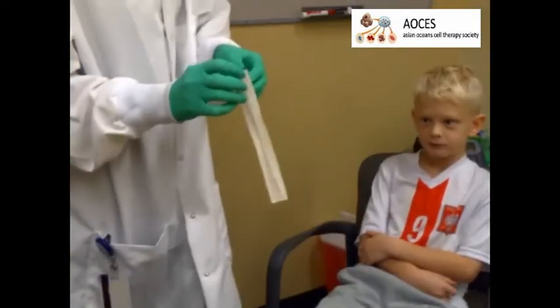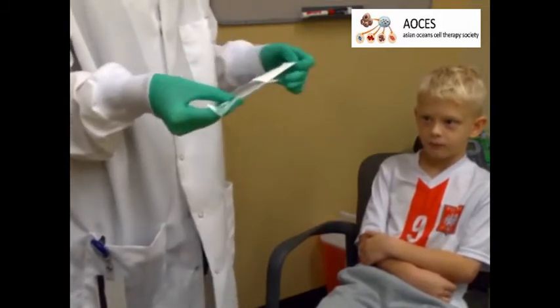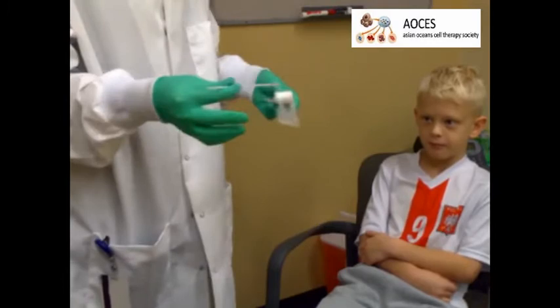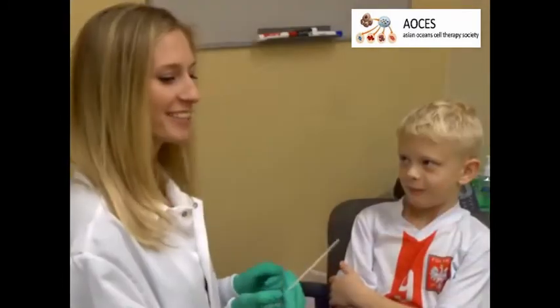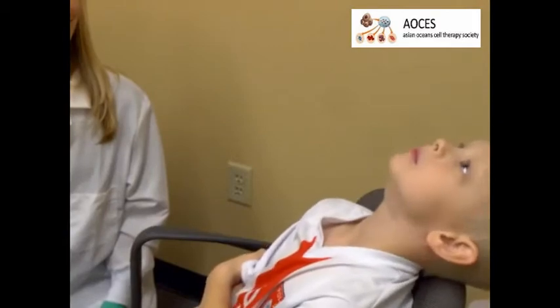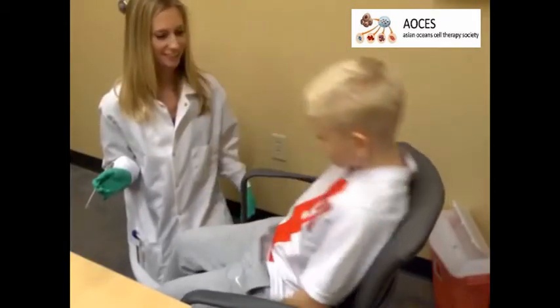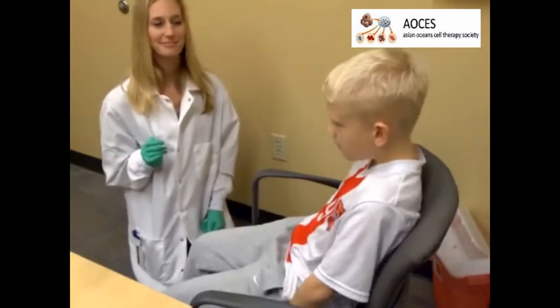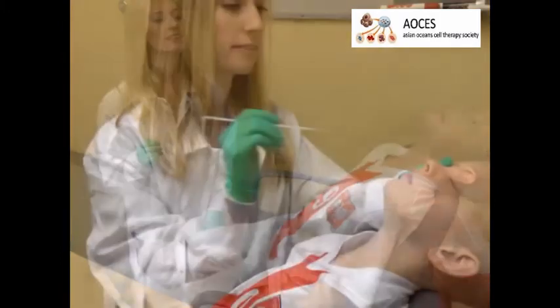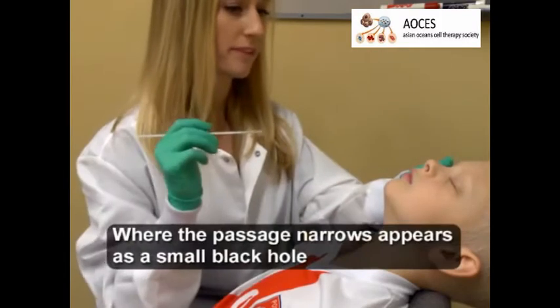Then, open a cytology brush immediately before taking the sample, and do not touch it to any surfaces to ensure that it remains sterile. Proceed to instruct the participant to sit still, and tilt their head upwards towards the ceiling. If they are restless, have them sit on their hands so that they do not attempt to swat the brush away. Next, aim and insert the brush to the back of the nose, where the passage narrows.